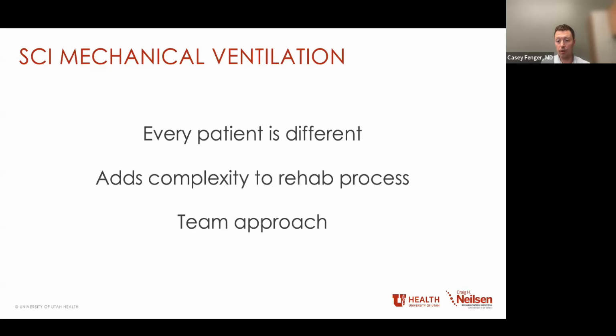What you're doing with the ventilator and the weaning process directly impacts what someone can do in therapy, right? If you push their respiratory muscles too hard, then they're not going to be able to participate in much therapy for a couple days. And so it really is tied to the whole process. And the team approach to vent weaning is huge. Those of you interested in rehab, maybe you've done a rehab rotation, there's a very team-based approach, right? And the vent weaning just adds to that.